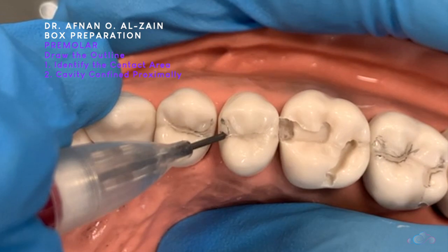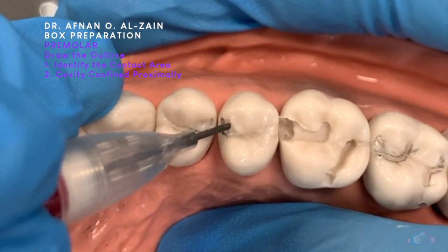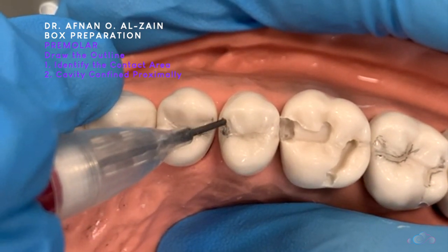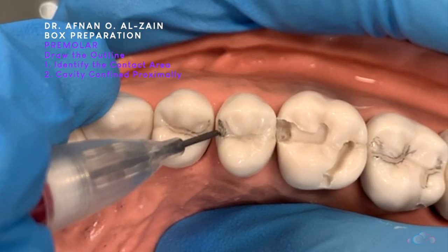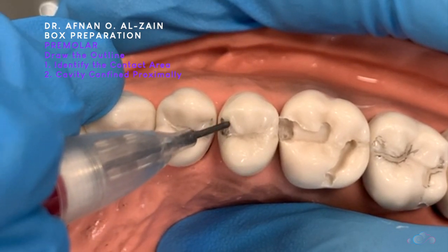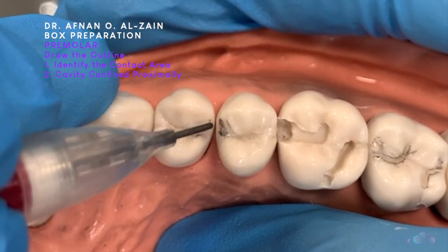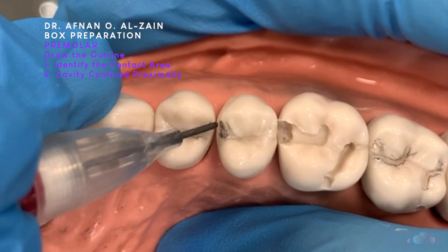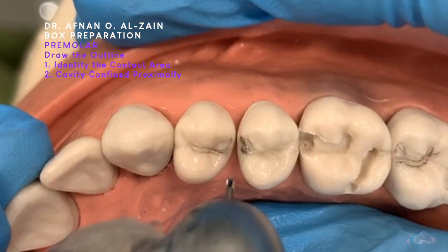And then here, lingually, as we said, it will be straight. And here our box is going to be. So it will be more buccally. As we can see, the contact area is more buccally.